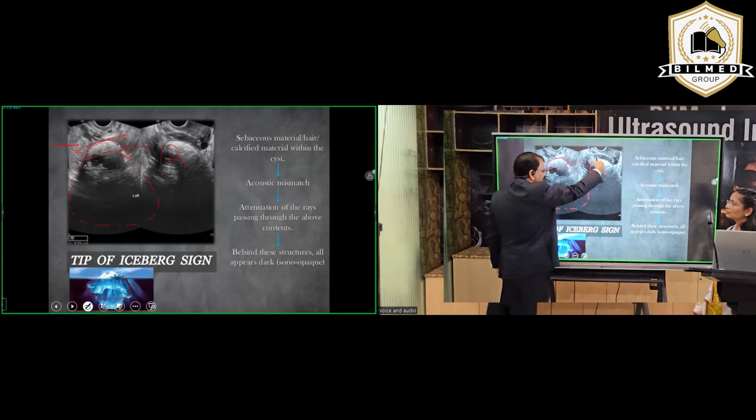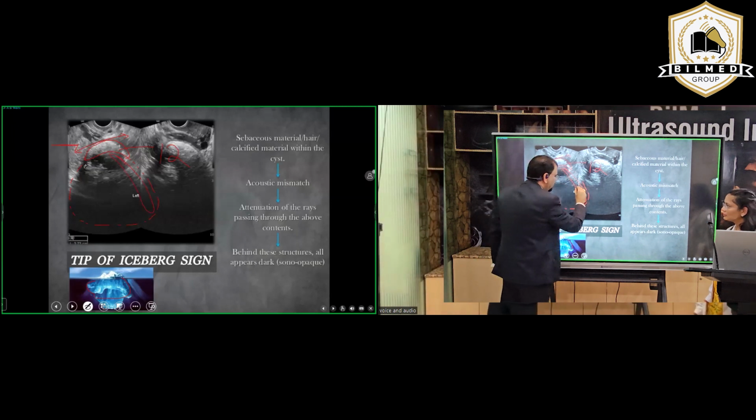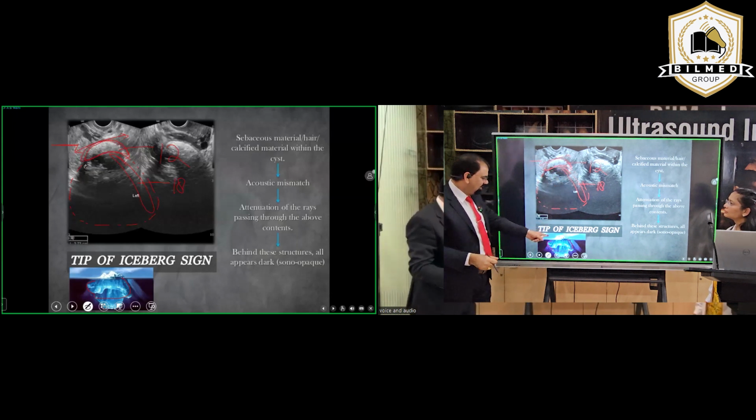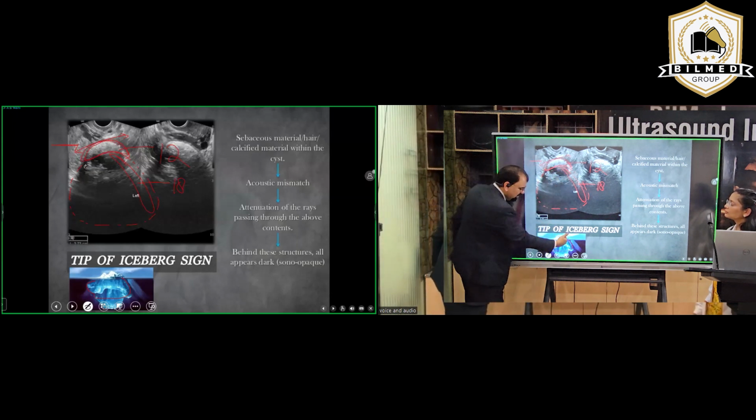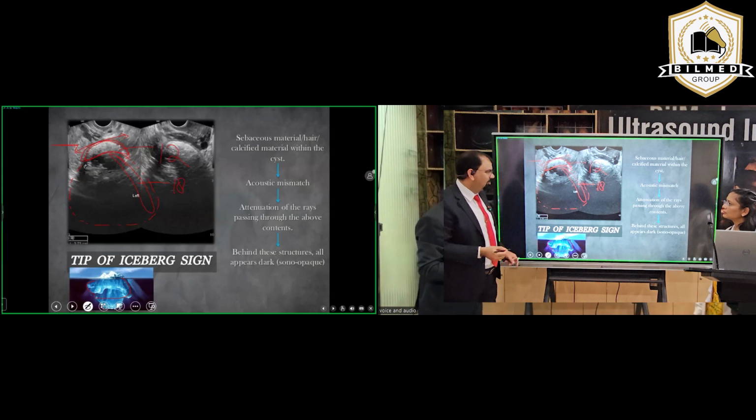You scan from here, it will now be more of 12 or maybe a less of 12. It will be 18. You tilt it more. You will see that this tip-like structure is elongating. Actually, this is not elongating. You are throwing beam from sides now and taking a maximum length. Take a maximum length. Then multiply.